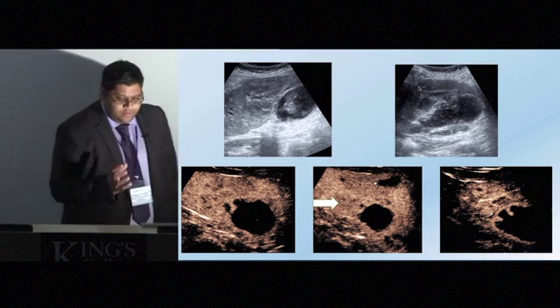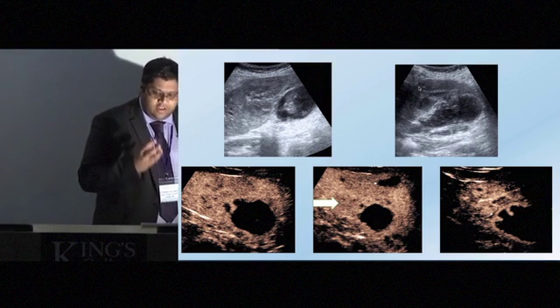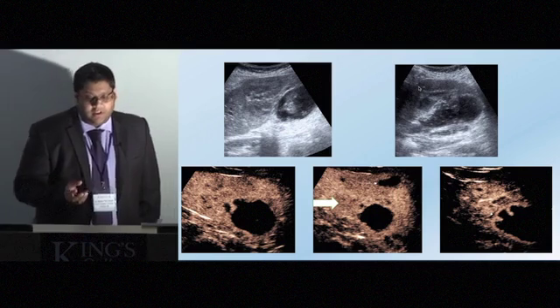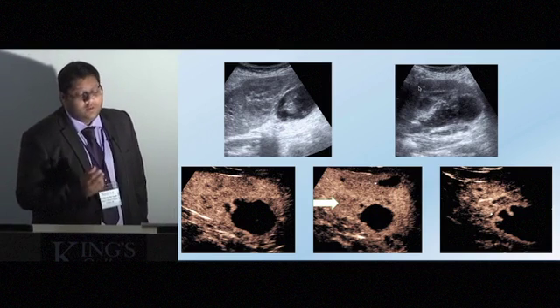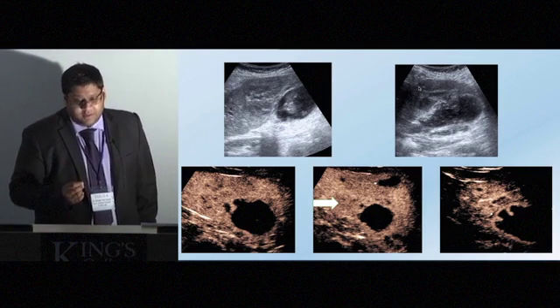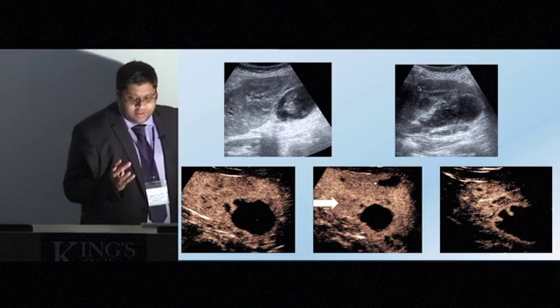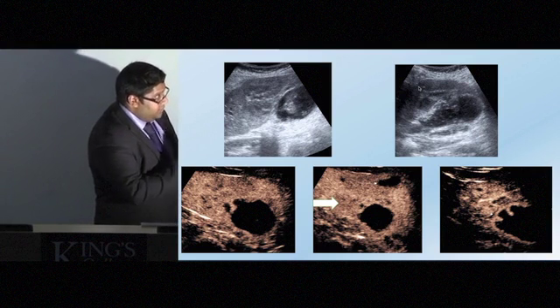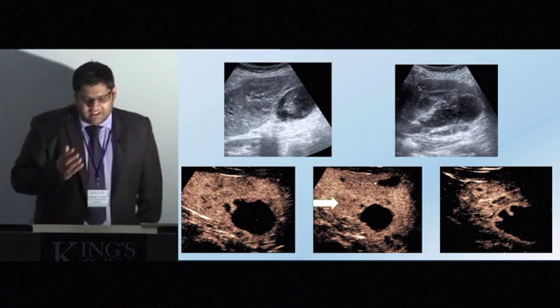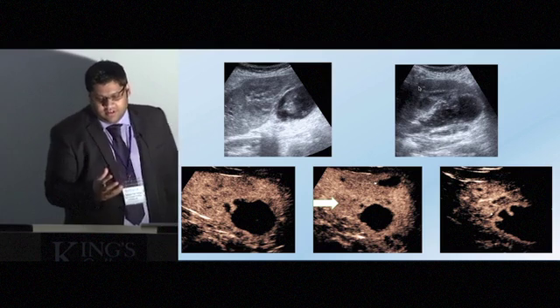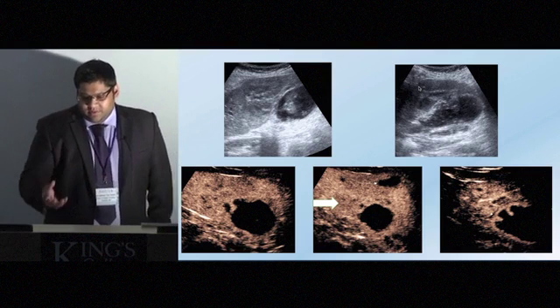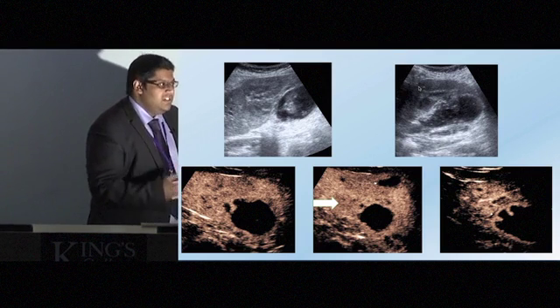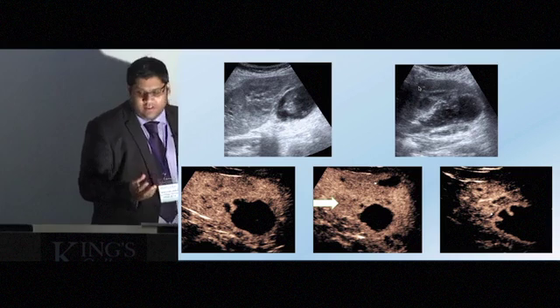Here's an example of how it can look in a different context. This is a patient with a gallbladder empyema which ruptured, causing an adjacent liver abscess. However, you can also see nodular areas of very defined washout in the central image. Contextually, we know this was a liver abscess and inflammatory region, but in isolation you could easily mistake that for a malignancy.